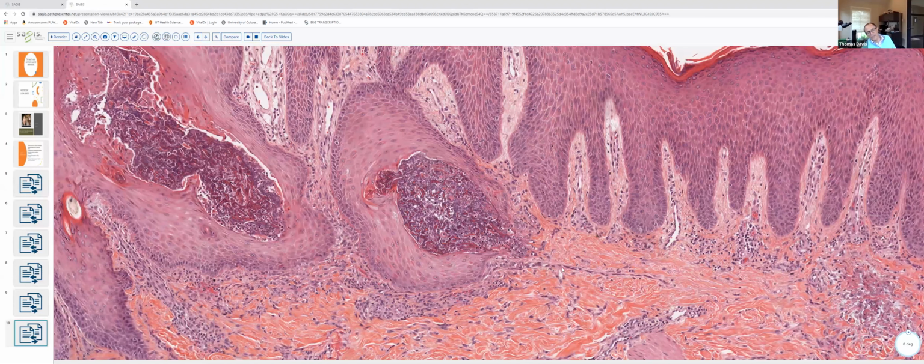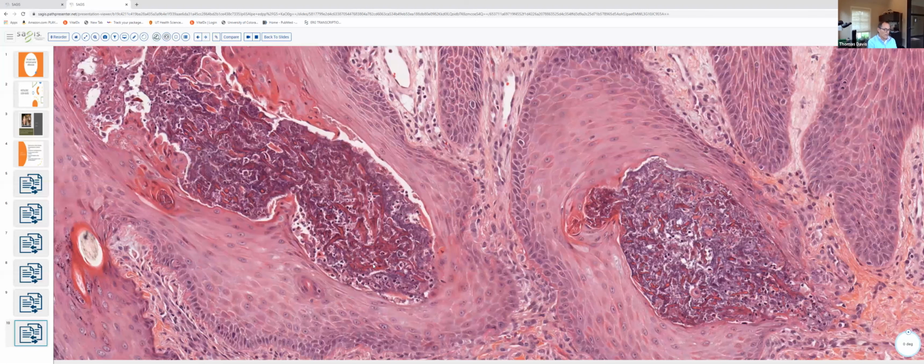And you can see within these channels, what you have is a marked increase in the number of these kind of large, bulky red elastic fibers. And this is a very characteristic appearance of EPS. So bulky red elastic fibers, number one. Number two, they're increased in number. And number three, the transepidermal elimination channel is going to be more narrow, tortuous, and course through a hyperplastic epidermis.